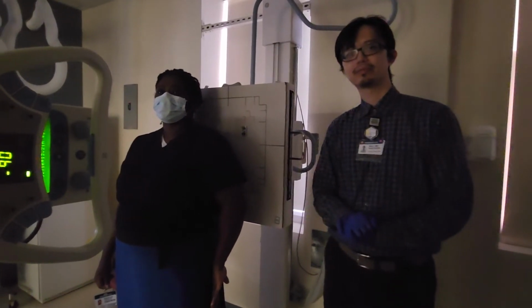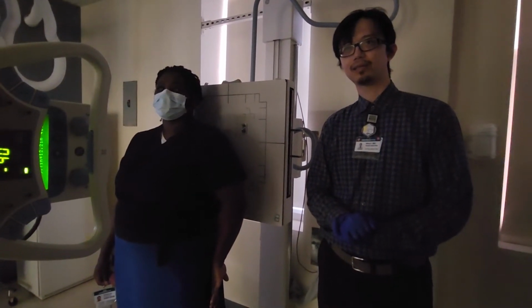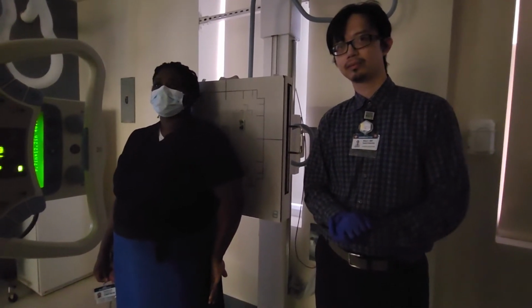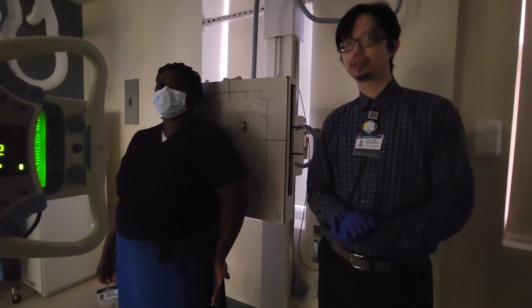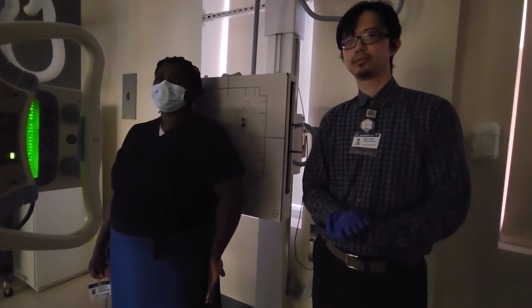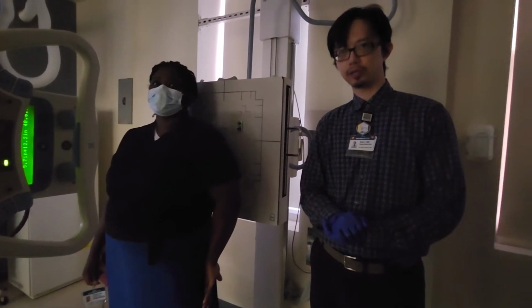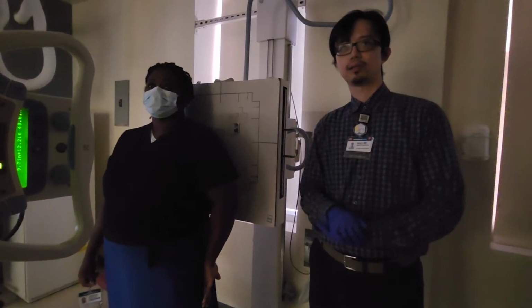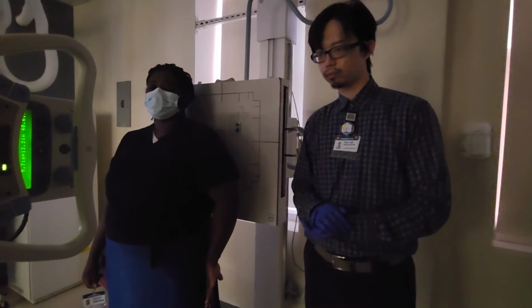Okay, and then for the transthoracic? Yes, the transthoracic or Lawrence. That one is short, like short, shallow breaths. Yeah. And then this one was, what was this one? This one was also suspend respiration. Okay, suspended respiration. Okay. Just hold your breath, X-ray, breathe. Okay. Right. No fancy breathing instructions. Okay. Cool. All right.